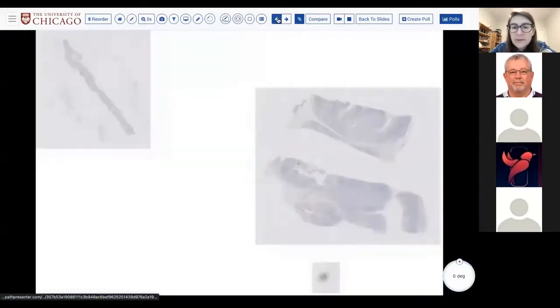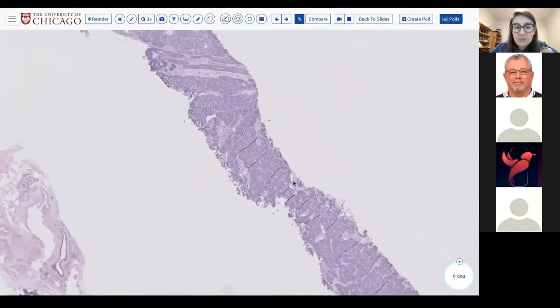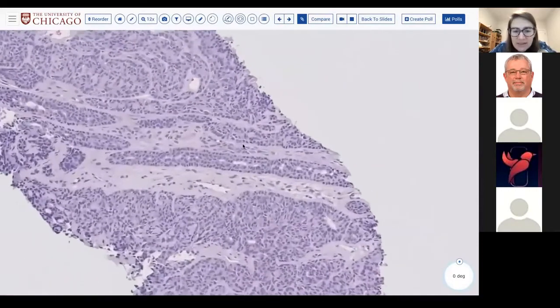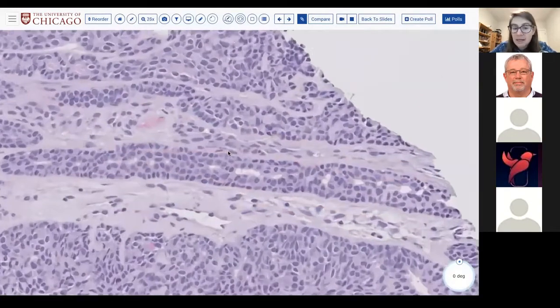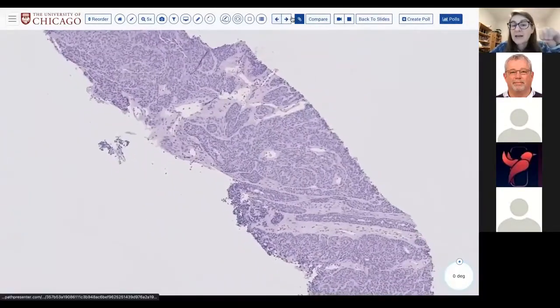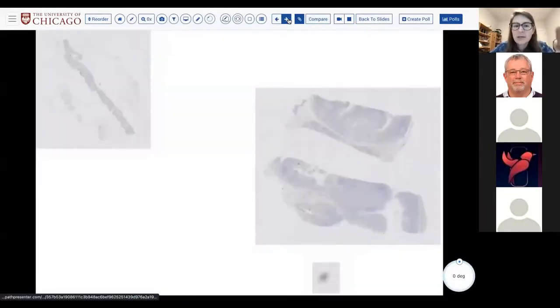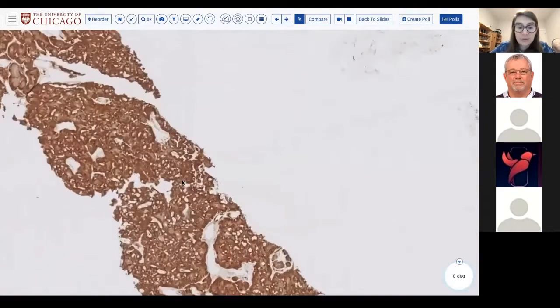And so if we go back, let's see if we can go back to the H&E and find that area. I've been using it because I think it's very good. And so it's these, let me see if I can annotate. It's like these areas here, right in between the glands that are strongly positive for S100. So if you can demonstrate that, based on your comparison of your H&E to your S100, I find it quite helpful, as well as then the beta-catenin to show localization very strongly within the cytoplasm, but more specifically within the nuclei.